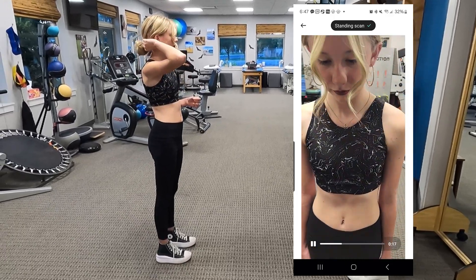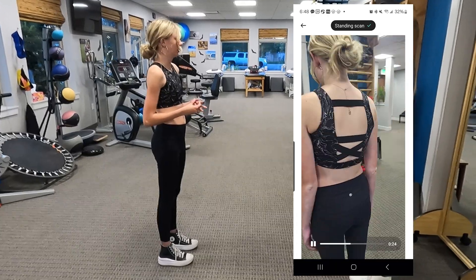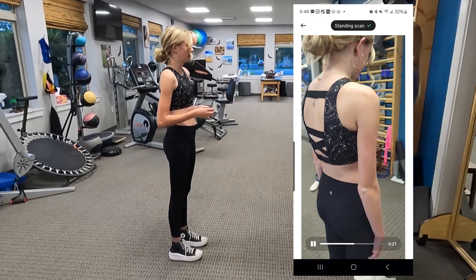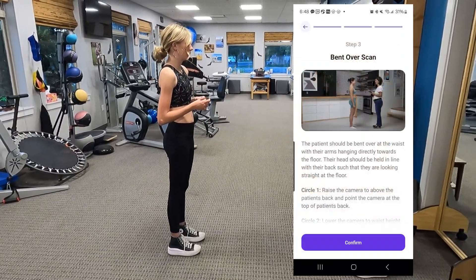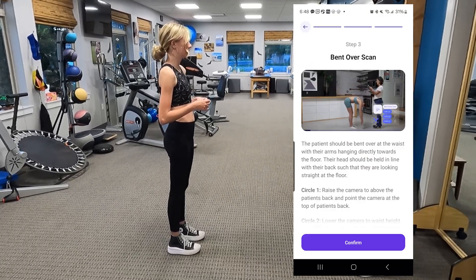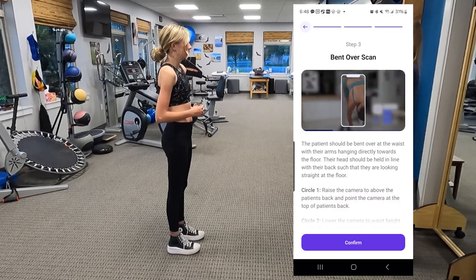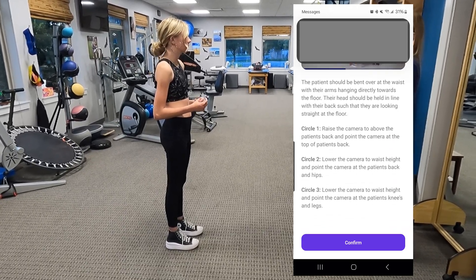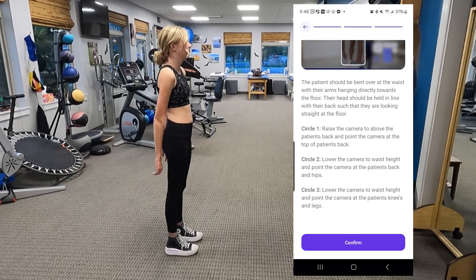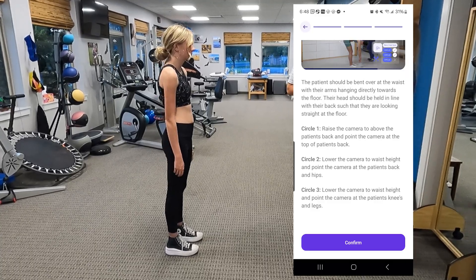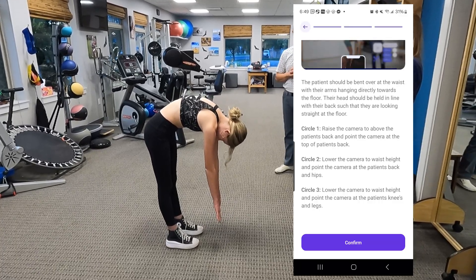One thing I might have had Addie do — she's looking down — I'd probably have her stand looking straight ahead, but that's okay. After the standing scan, it has you do a bent-over scan where you're bending forward, and that gets a look at the rotation of your back — kind of like when you're in the pediatrician's office and they have you bend forward to check for that rotation. We're doing three circles again. So just bend over like you're doing a scoliosis check, arms out and hanging, and hold that position.